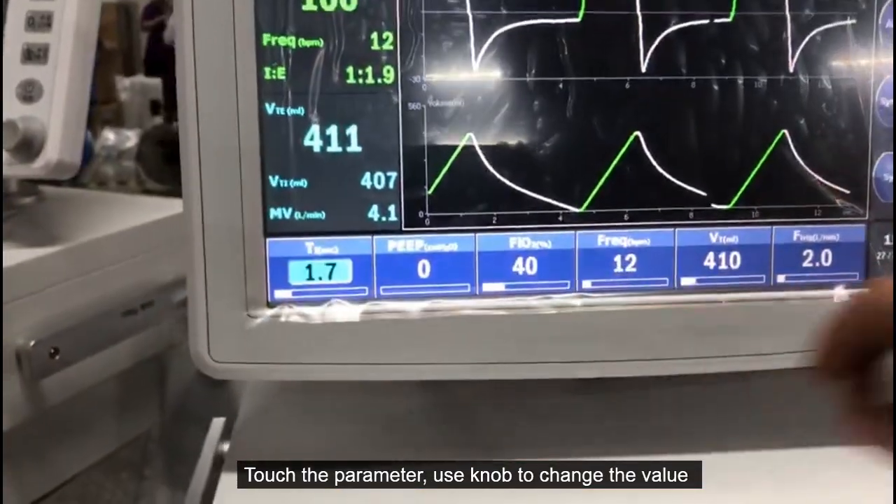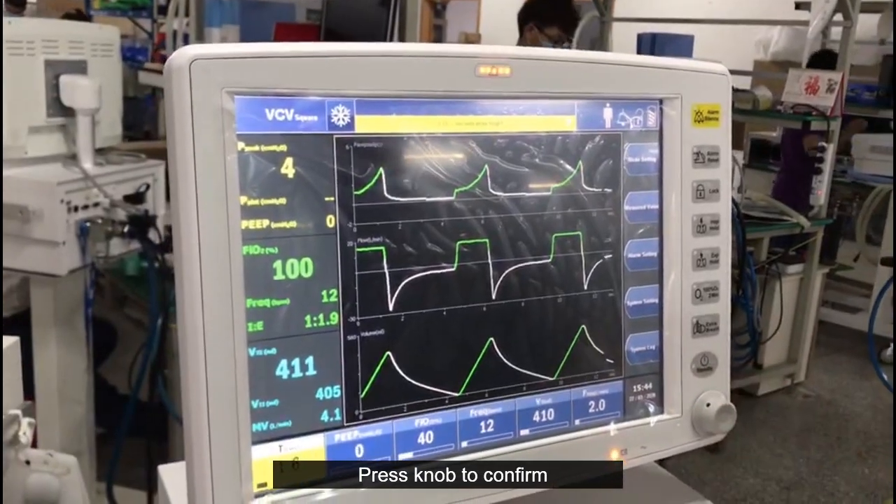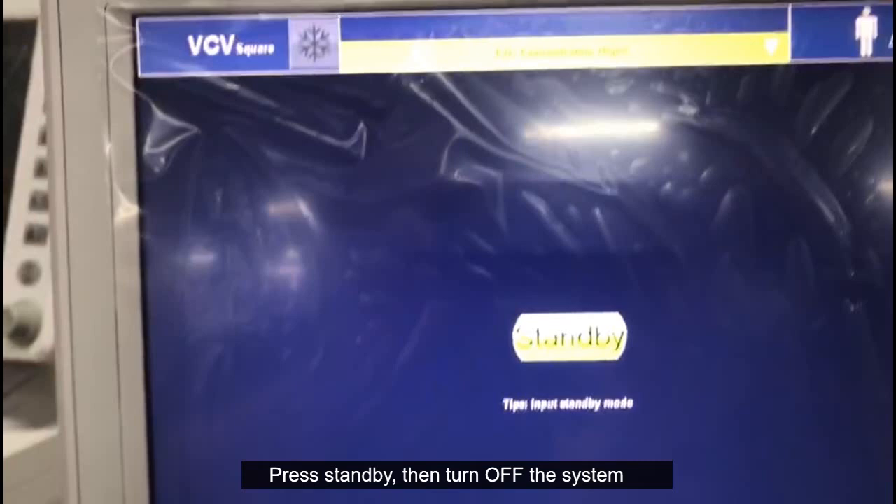Touch the parameter and use the knob to change the value, then press the knob to confirm. Press standby and then turn off the system.